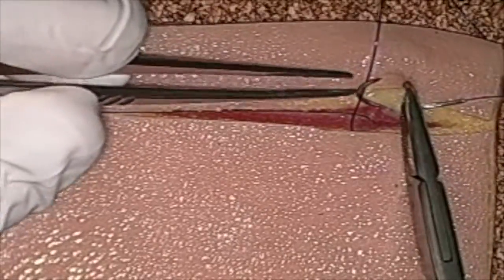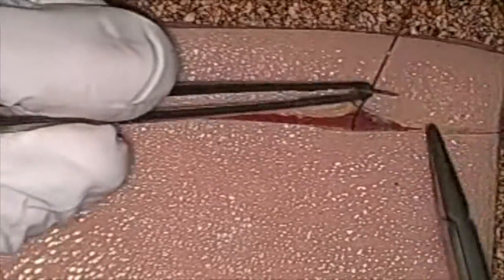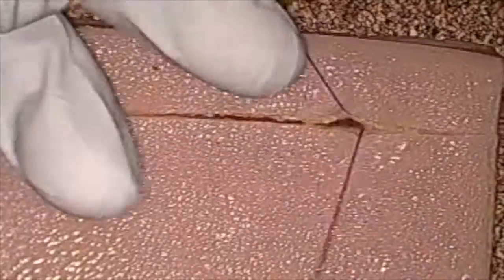Take nice, hefty bites. As you can see here, we're doing deep to superficial, superficial to deep. You may have to have your assistant hold the tissue open so you can visualize it. But this is a good way to practice ensuring that your knots slip down properly and go much deeper than you need them to be if it was just the skin sutures.